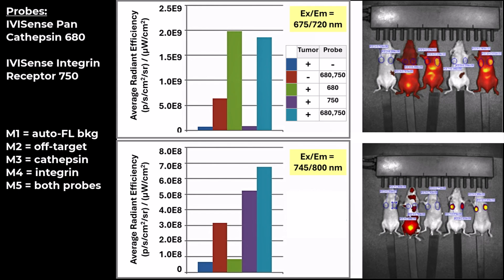But it is important to note that the signal magnitude by bioluminescence imaging would not be expected to correlate perfectly with the near-infrared fluorescence. Bioluminescence provides readout on tumor burden, whereas fluorescence provides biological marker quantification. As you can see, careful experimental design will allow for extremely fast and accurate estimation of underlying molecular activity, largely circumventing issues of background signal and crosstalk.